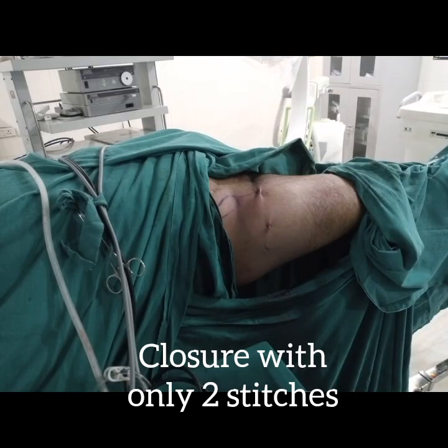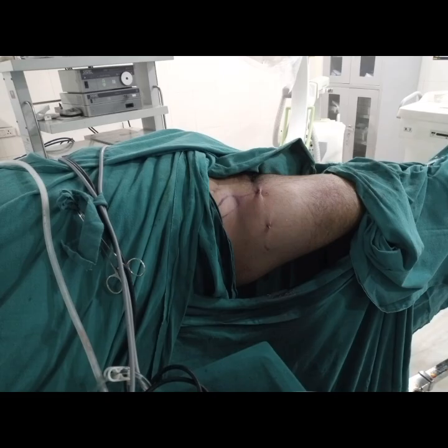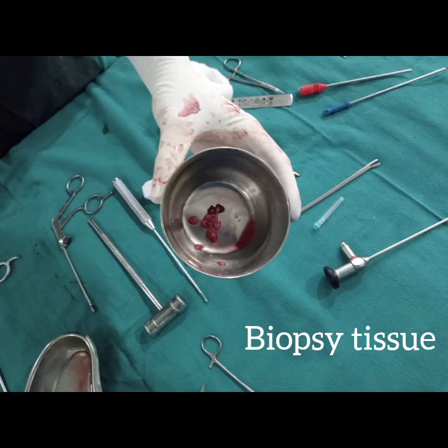This is a minimally invasive procedure, so only 2 sutures are done. This is the biopsy material from the capsule and the synovium.